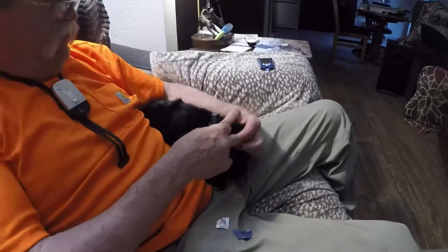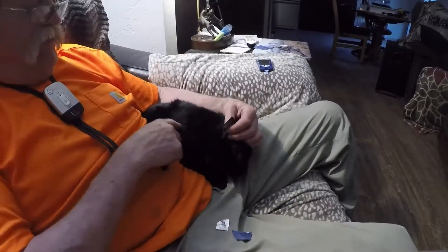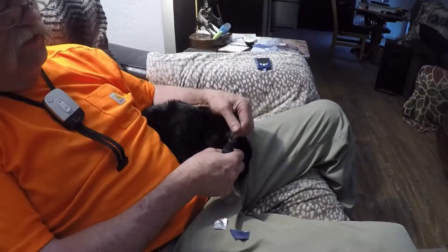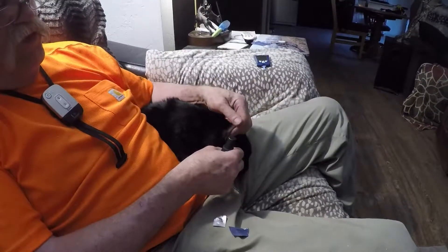I sit and hold the cat in my arm here, and I'll rub my thumb along the edge of the ear, whichever area I'm going to go.